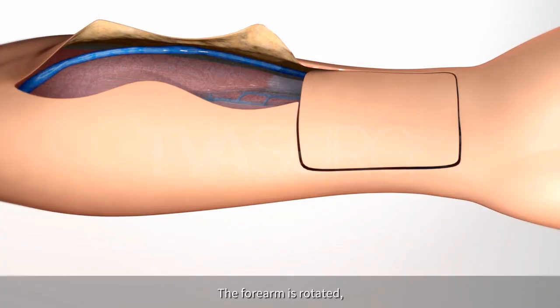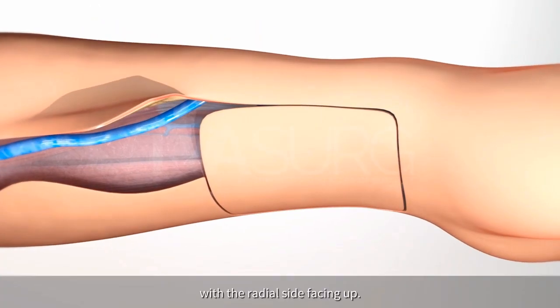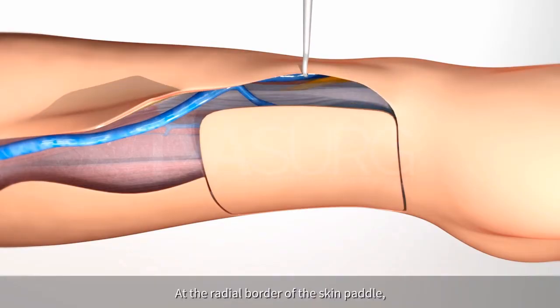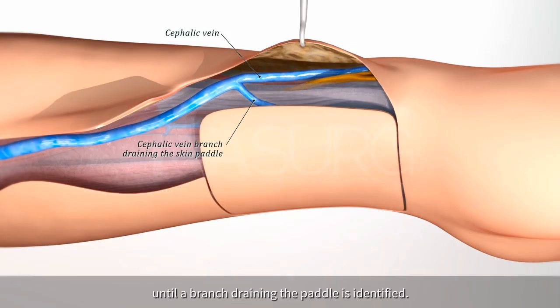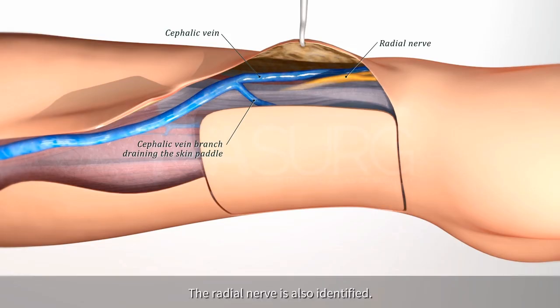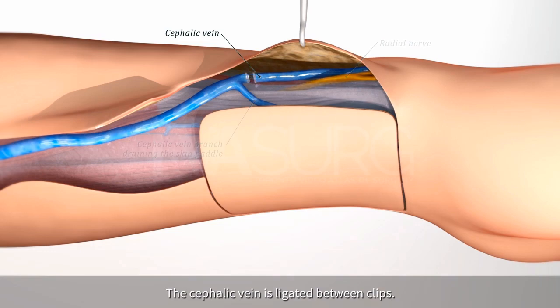The forearm is rotated with the radial side facing up. At the radial border of the skin paddle, the cephalic vein is traced distally until a branch draining the paddle is identified. The radial nerve is also identified. The cephalic vein is ligated between clips.